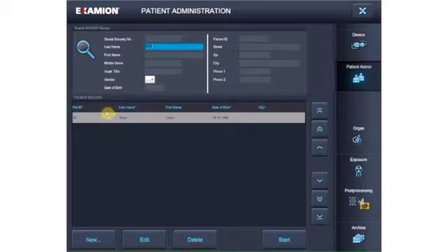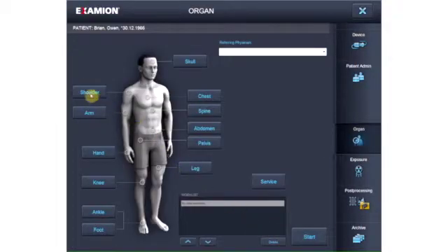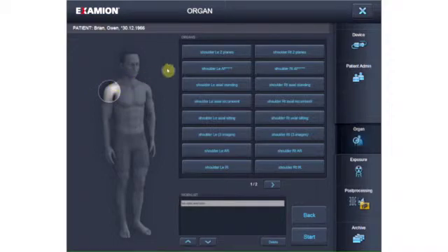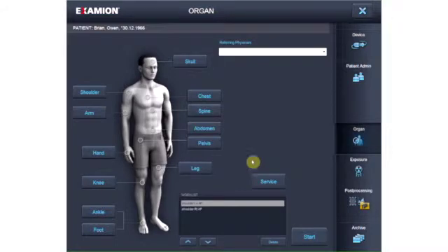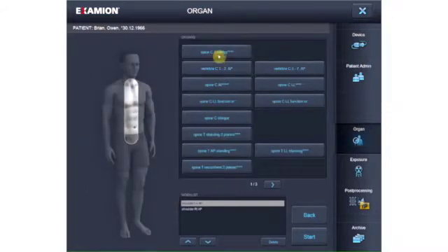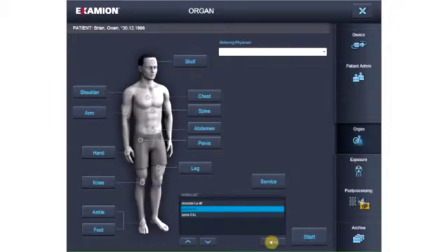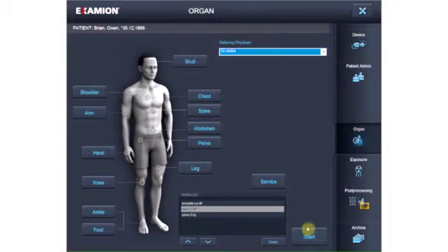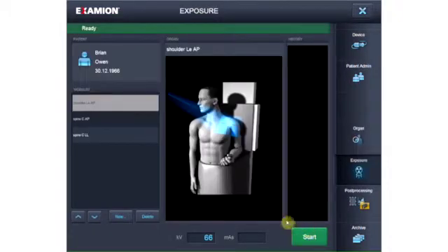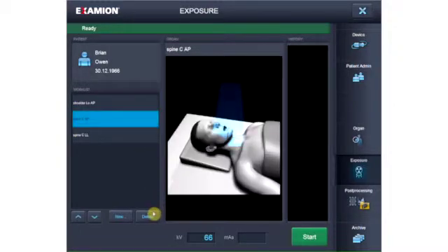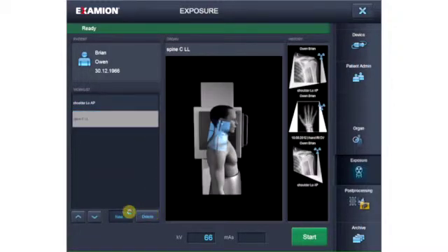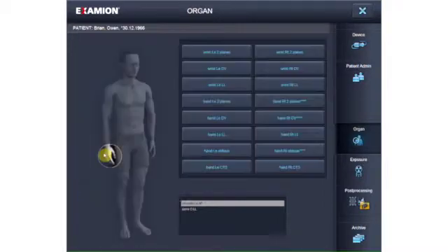After the patient is selected, the order is generated by selecting the organ group and the organ. You can delete orders from the work list and add the name of the referring physician. The positioning images aid you in positioning the patient correctly and collimating the organ to be x-rayed. The work list contains all pending x-ray orders, and an order can be deleted or regenerated. The exposure parameters automatically created by the generator can also be changed manually.